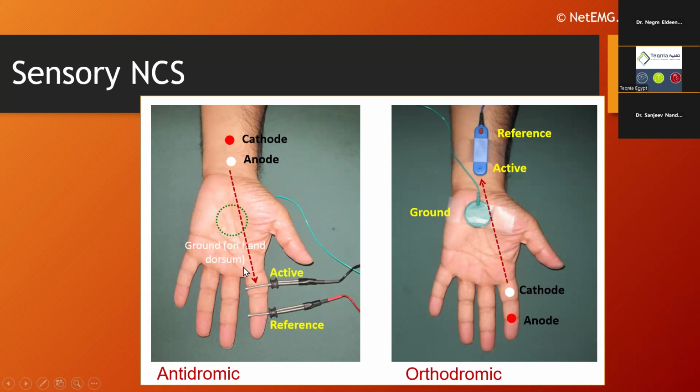Keep in mind, in a motor nerve conduction study, although we call it a nerve conduction study, we are recording the responses from the muscle. And there is a biologic amplifier. Each nerve axon will innervate maybe 50 to 100 or even more muscle fibers, so you get large amplitude responses. In sensory nerve conduction studies, we are recording low amplitude, short duration, individual sensory axon potentials. So the signals tend to be much smaller.